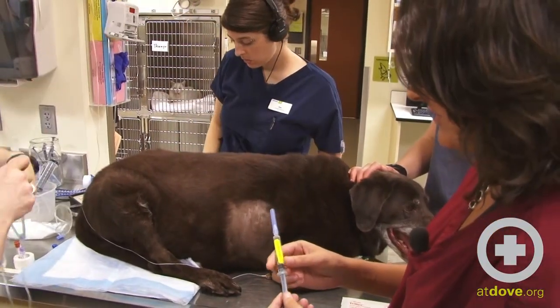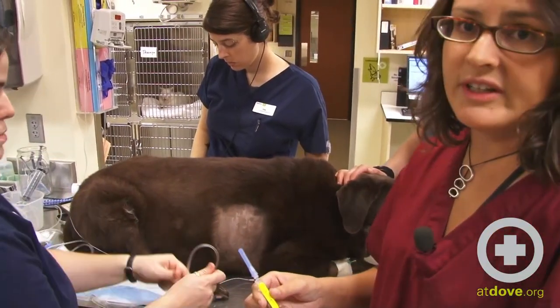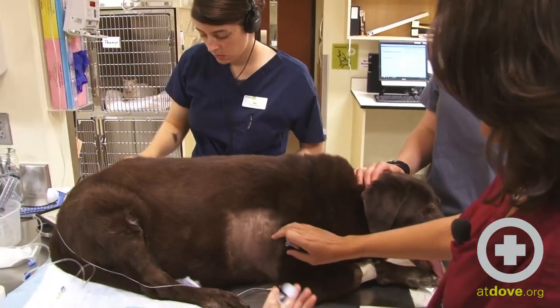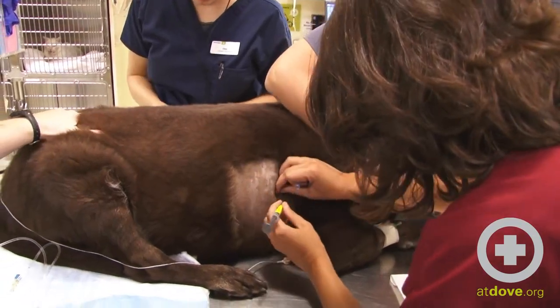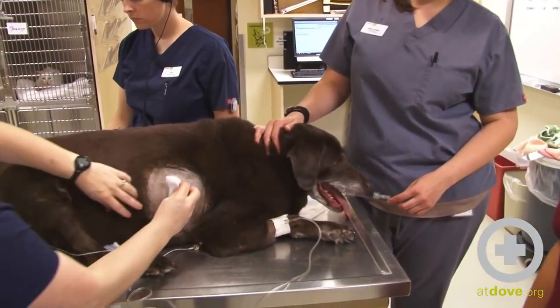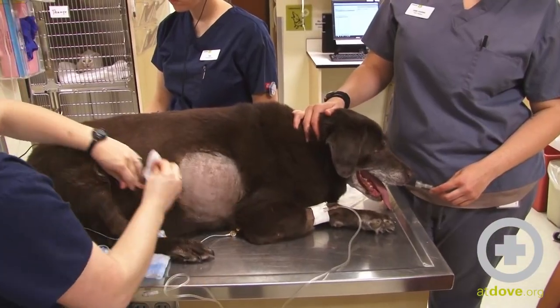I have lidocaine diluted one to one with sterile saline, two percent. She's already received hydromorphone for pain control and she's going to be started on fluids momentarily. At this time we're doing a sterile surgical scrub with dilute chlorhexidine and alcohol to prepare the site for the tap, as it should be done under sterile conditions.